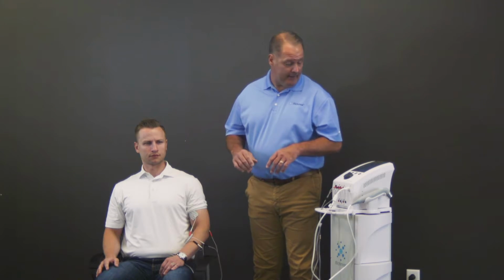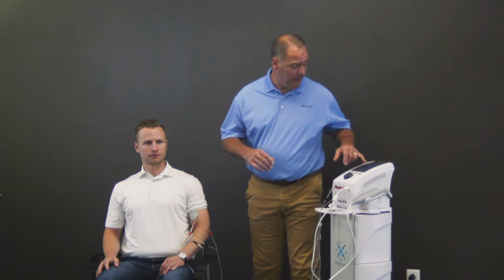That's a low, small, methodical beating, and that runner's high gives you that release of morphine. That's one reason why I don't run. I don't want to get addicted to my own body's morphine. But if you sweep those low frequencies, you'll get the endorphin release, and then sweeping all the way to 150, you get your enkephalin release, effectively treating your pain much better.